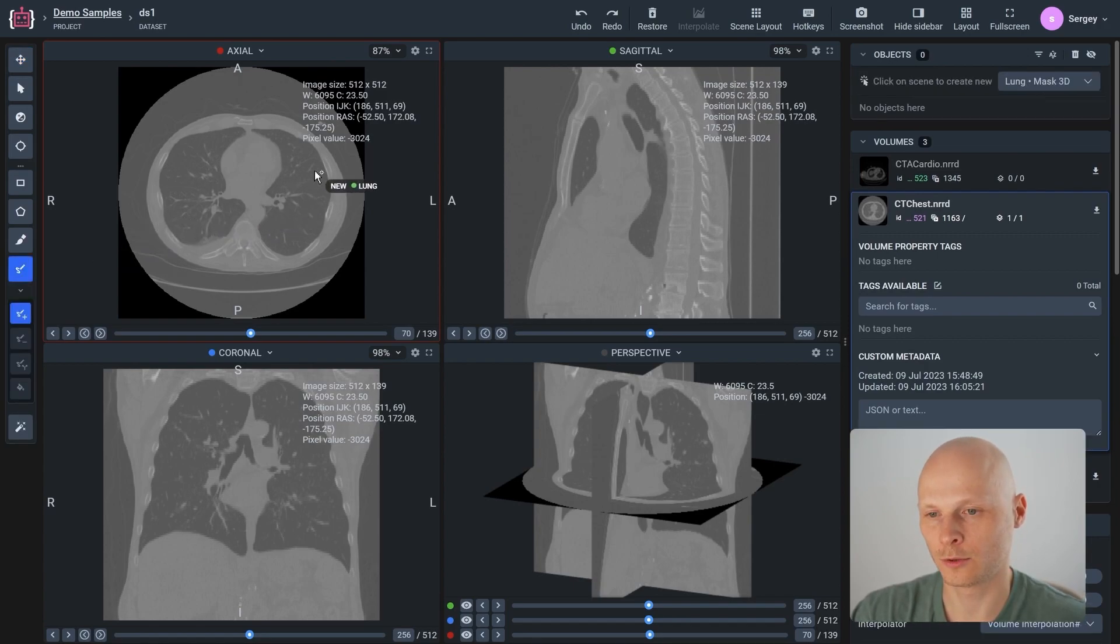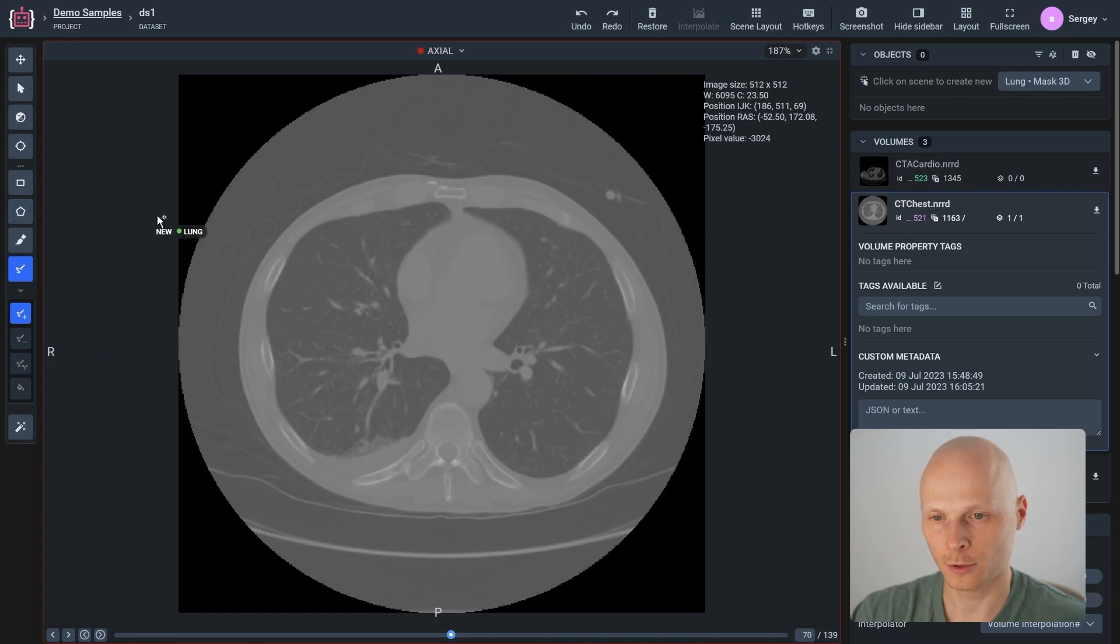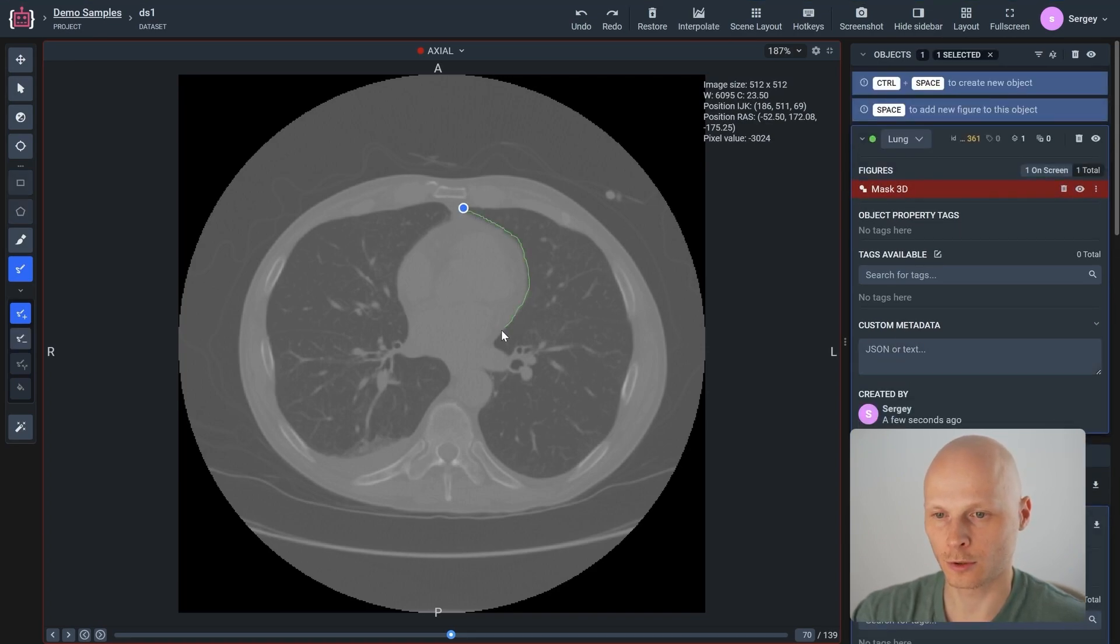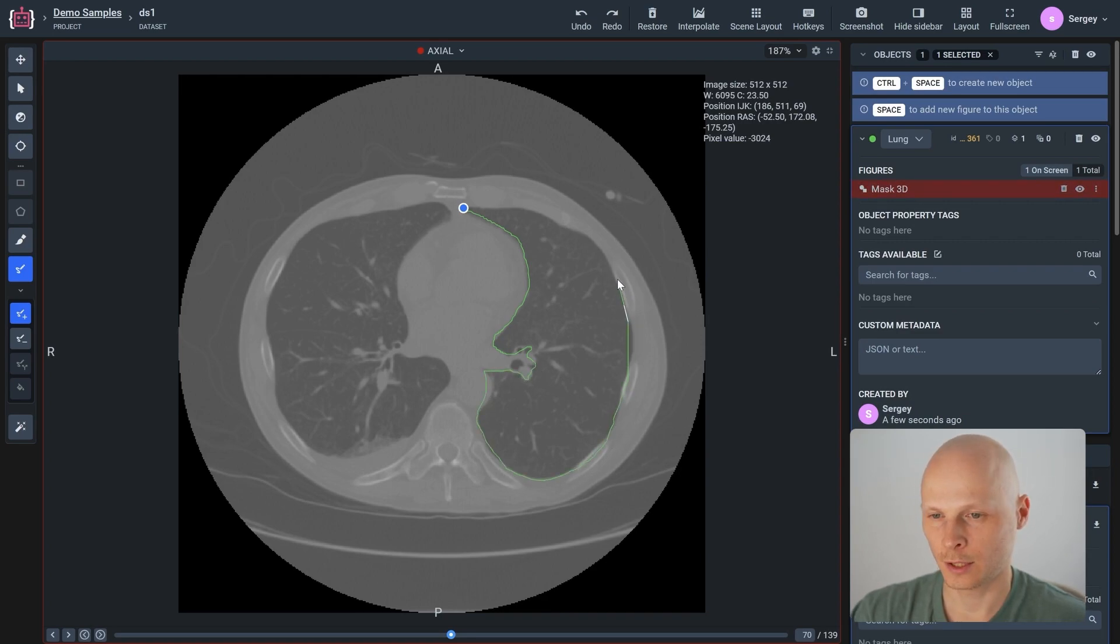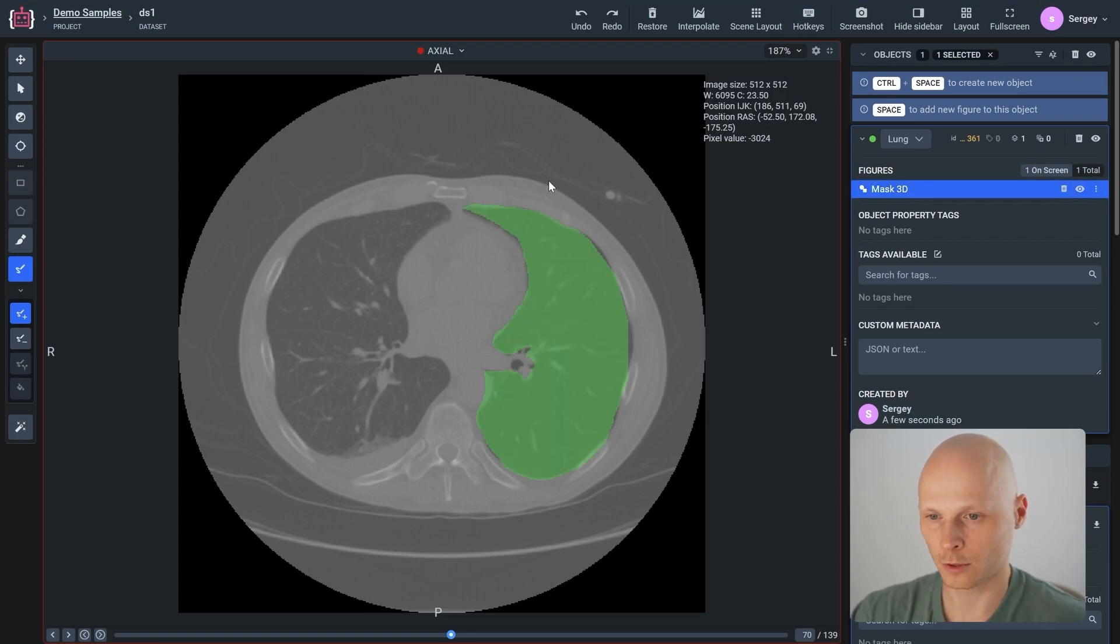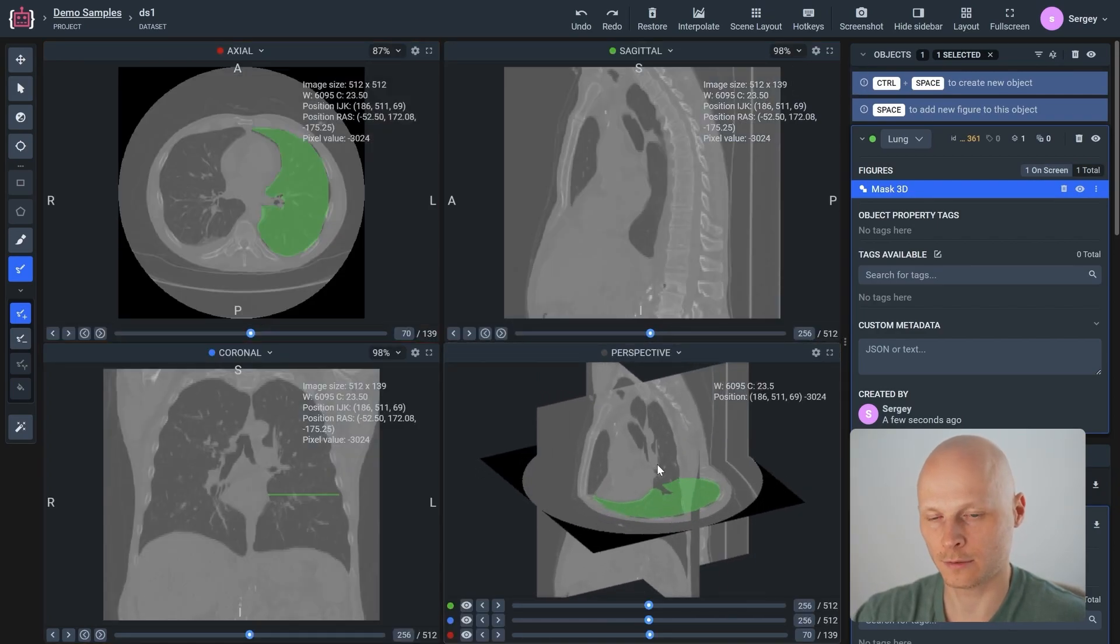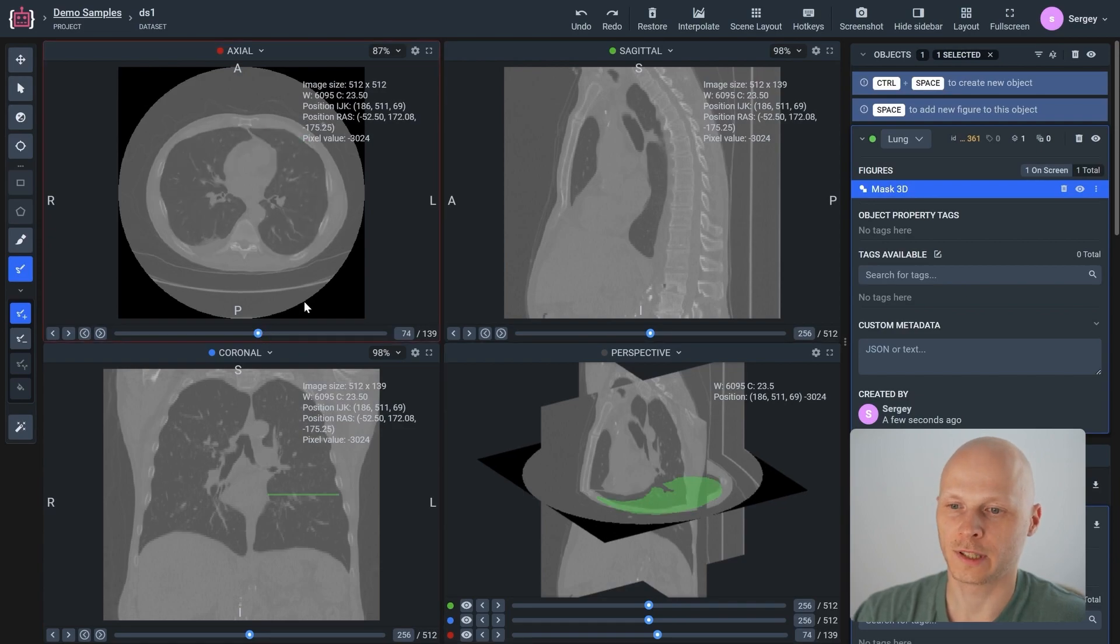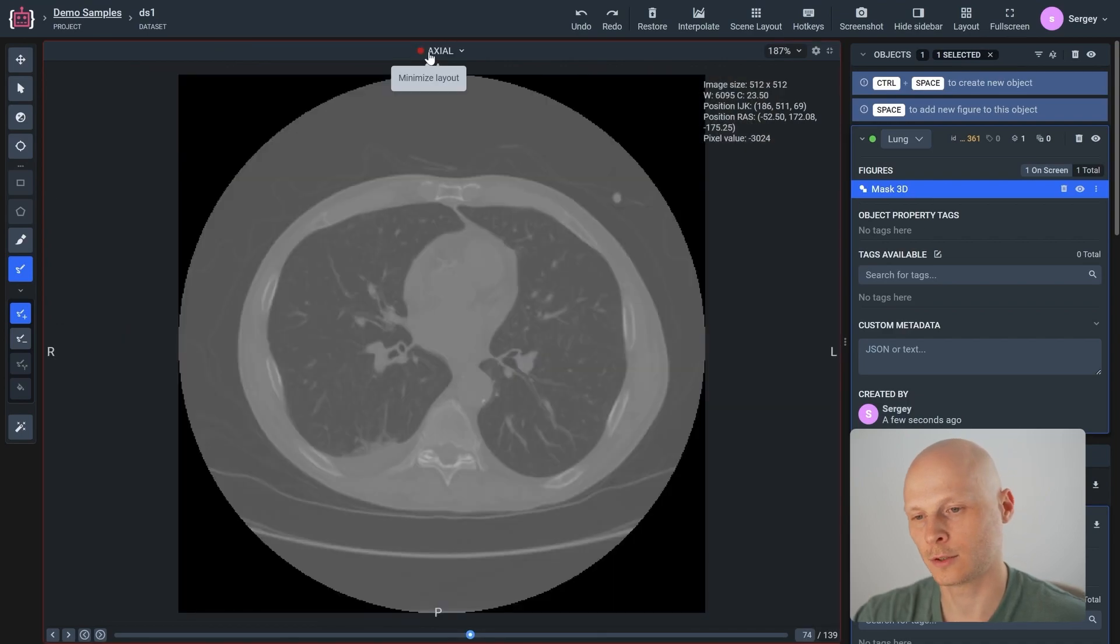For example, we can use the pen tool. I select a plane and start labeling the object. The pen tool can be used in combination with a brush and polygon for annotations. Just hold mouse button and draw a smooth line around the object. You can release mouse for straight lines. Once we close the contour, the mask will appear and we can see this mask on the 3D projection. We can navigate across different slices of the plane and label objects with the pen or the mask tool.